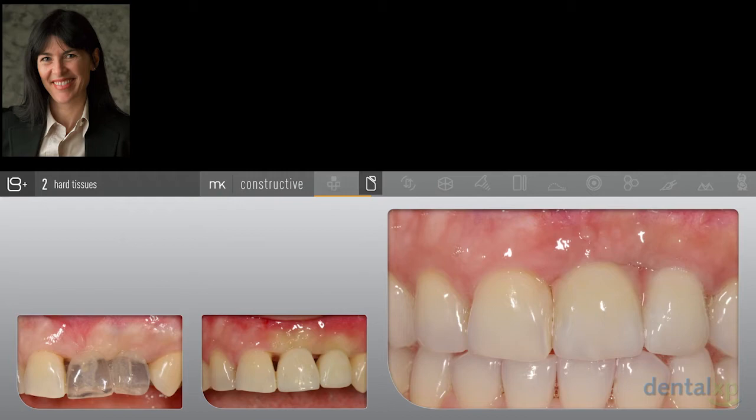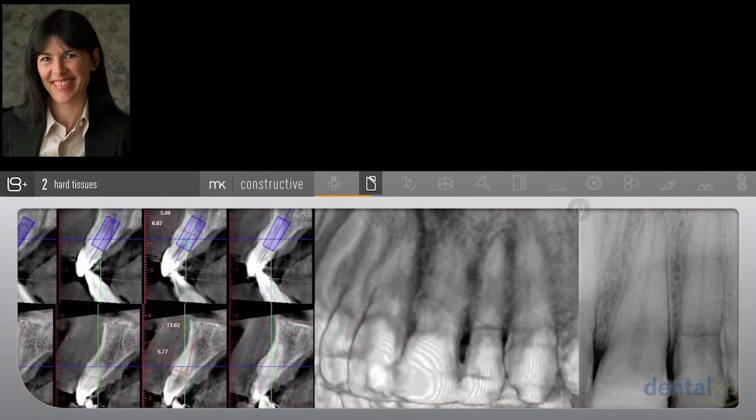So here we've rebuilt the deficient soft tissues with pink ceramics, and with a reasonable result, especially with a natural smiling distance, but it's not my gold standard or what I aim to produce. But the reality is that when we look at the limitations of papilla, I constantly remind myself to treatment plan before I treat, because every once in a while we get very eager to get in there and just get going with the treatment, but you've got to sit back once in a while and think about what will the outcome be and what could I do different to make it better.